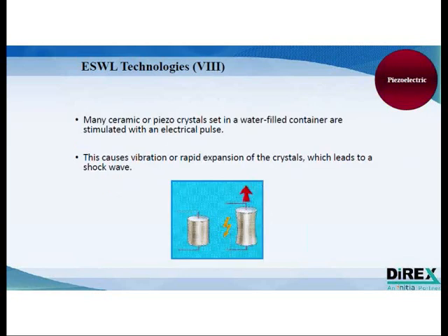The last technology is the piezoelectric technology. By passing current through a crystal, you can cause this crystal to rapidly expand and go back to its original shape. The crystals are placed in a parabolic formation. There are a few thousand crystals used at once, and if you cause all these crystals to expand and come back at the same time, you are essentially causing the formation of focused energy.